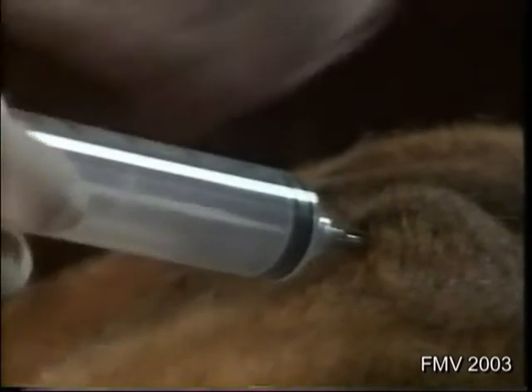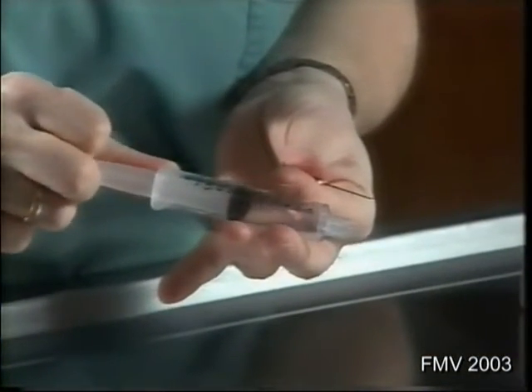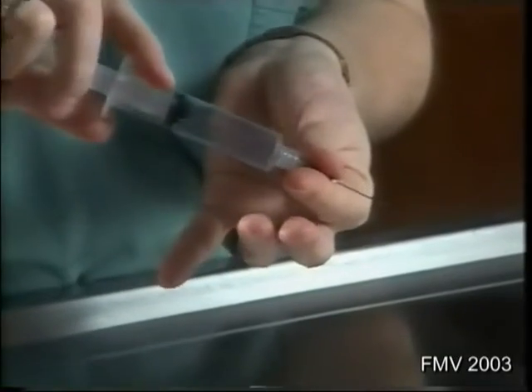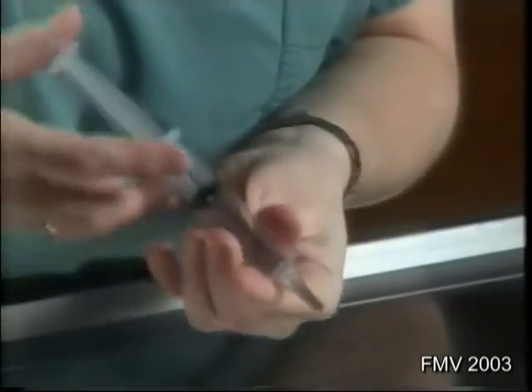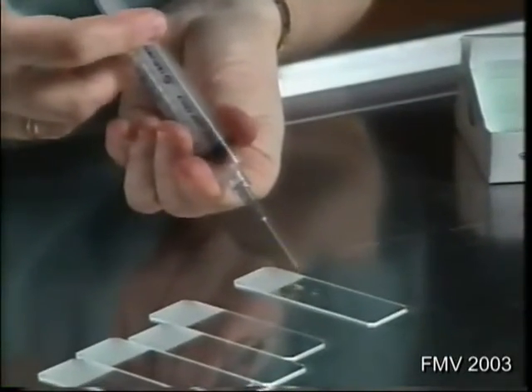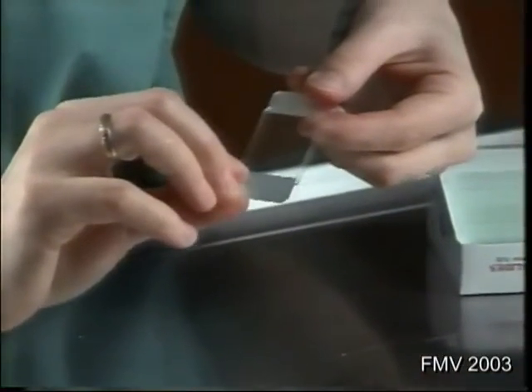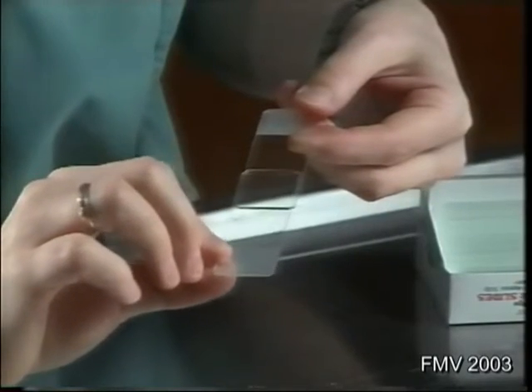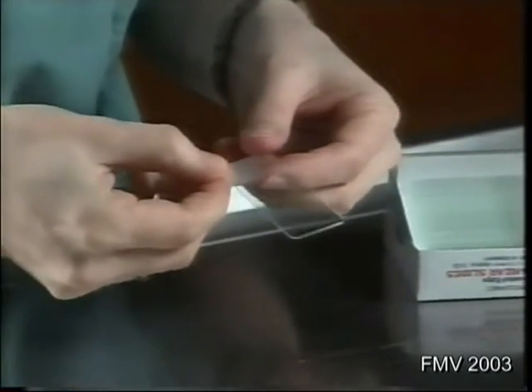Detach the syringe, pull the plunger back to load the syringe with a few cubic centimeters of air, reconnect syringe and needle, and eject the needle contents onto the end of a glass slide. Spread the specimen by gently laying a second glass slide over the first without applying pressure. Too much pressure will damage the cells and result in a non-diagnostic sample. Allow the specimen to air dry.